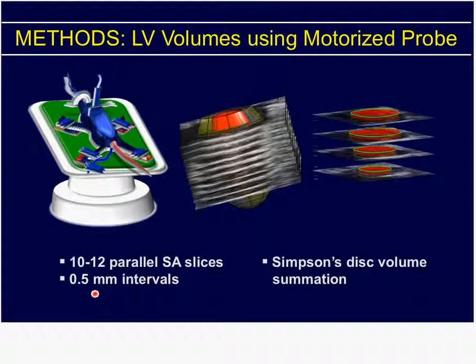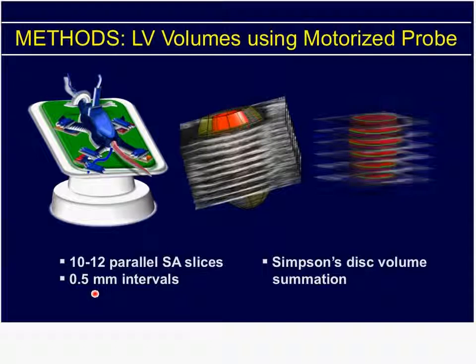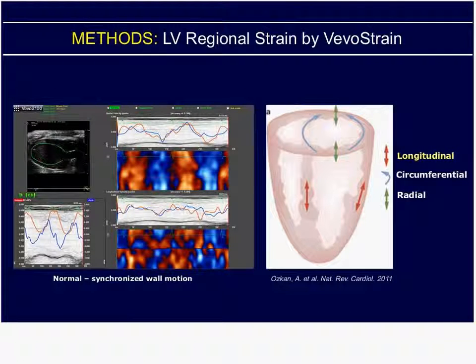And so this is high-resolution imaging, and we're doing this in a very MR-like analysis. We're taking a dense short-axis stack and doing image analysis on every slice.